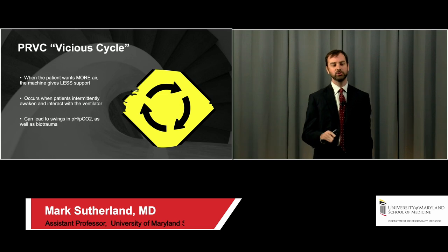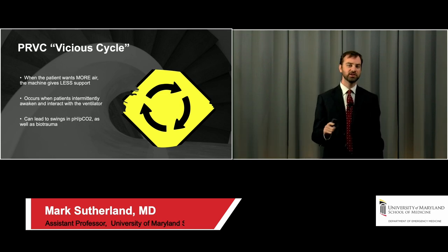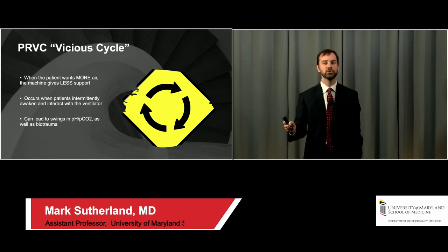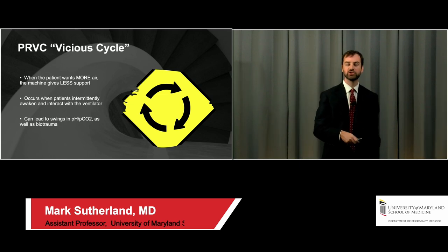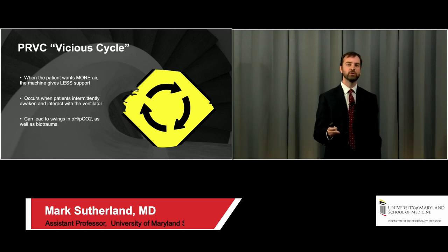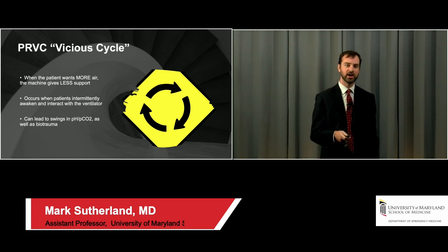And actually, I alluded before to PPS and PAV, which I'm not really going to talk about today. But interestingly enough, the dynamic of PRVC in this situation is the exact opposite of PPS and PAV. So there are other modes which do the exact reverse. When the patient wants more support, they give more support. In PRVC, the opposite happens. The more air the patient seems to demand, the less they get. And so this causes a pretty significant limitation of PRVC when the patient's awake and interacting with the ventilator.